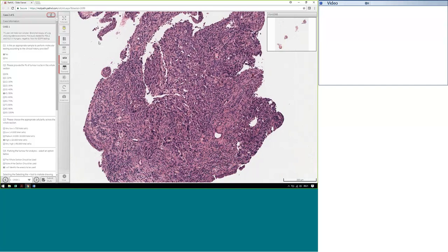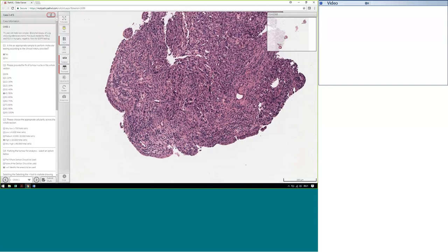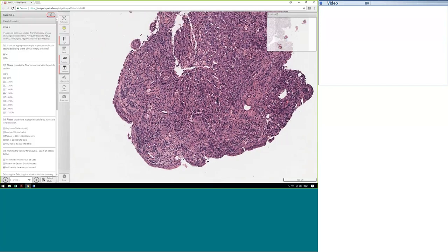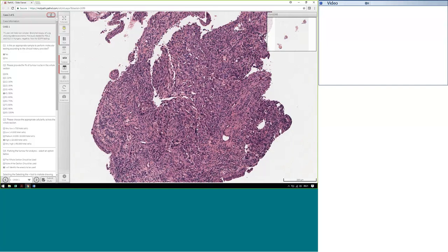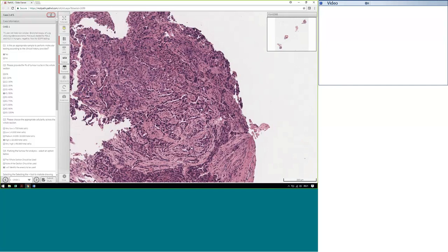Jane? Yeah, again, agree with everything. Obviously the tumour cells are quite large, so the surface area is not a good indication. So that's why we've gone with percentage and the medium cellularity, I think, when we were discussing it previously. Yes, yeah.